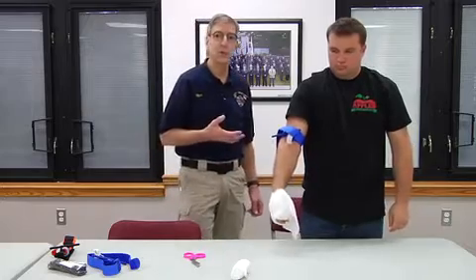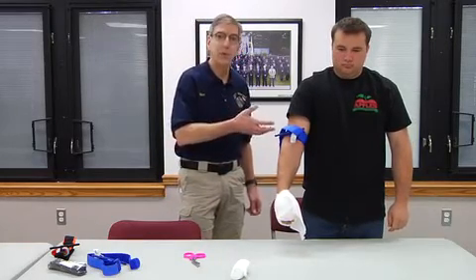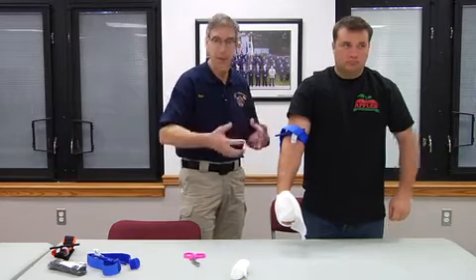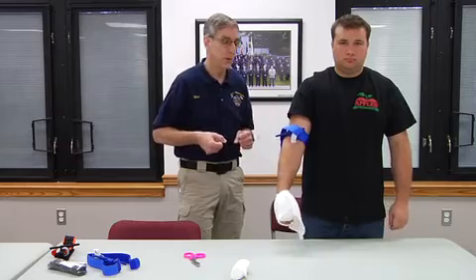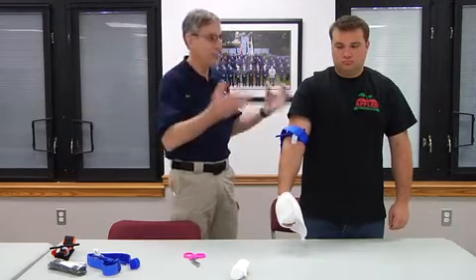So you think about a situation like this and how quickly you're able to do that, and probably this requires some extra iterations until you can rapidly get a tourniquet on yourself. And you can create tension in the environment by yelling at people and telling them to move faster.